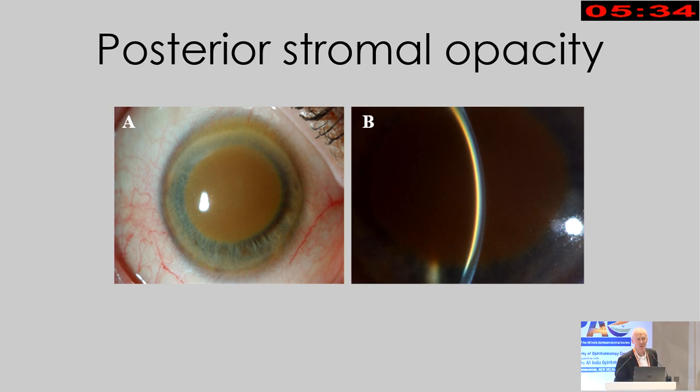Femtosecond lasers don't work well in the posterior stroma for a lamellar cut, by the way. They don't produce a regular or a good clean cut. So do a lamellar dissection first, take the patient upstairs to the femtosecond laser, do the ring cut, and then it's a beautifully easy operation technically to do a DLEK.